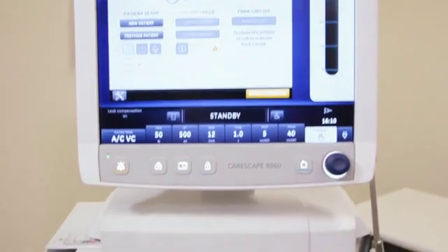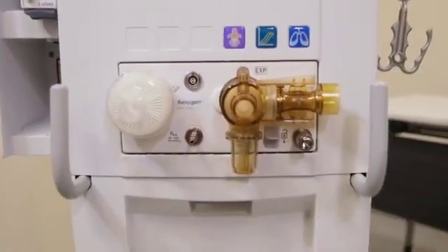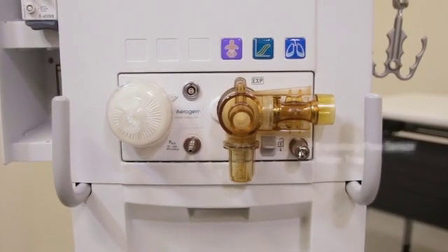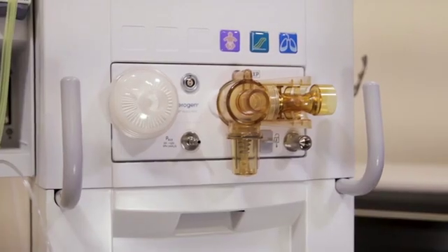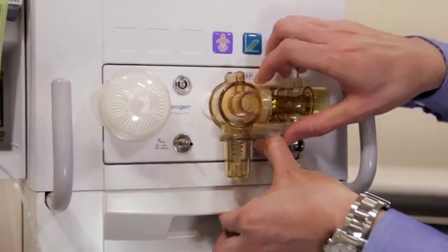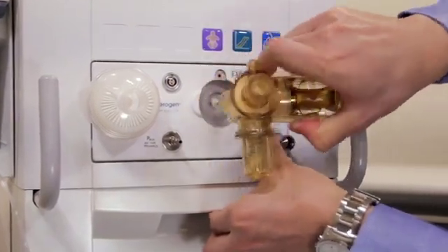First, I will show you how to remove and clean the exhalation valve housing. The exhalation valve housing of your CareScape R860 ventilator contains the expiratory flow sensor and water trap. To remove the housing, press down the latch to release the exhalation valve housing and then pull the housing from the ventilator.